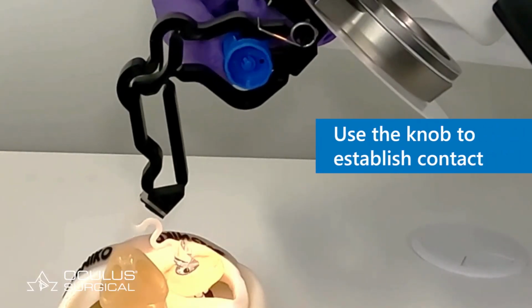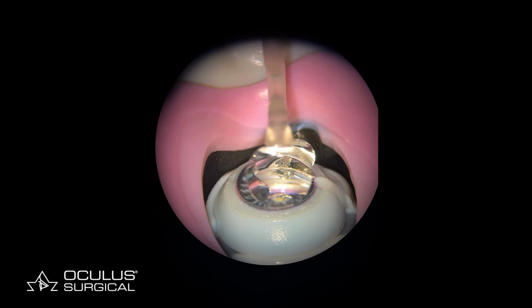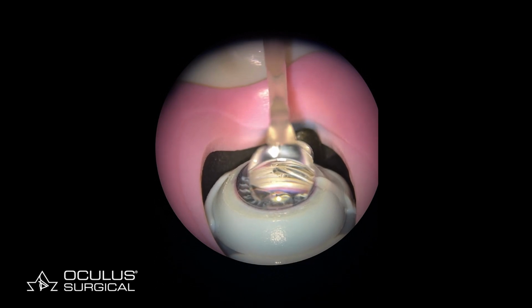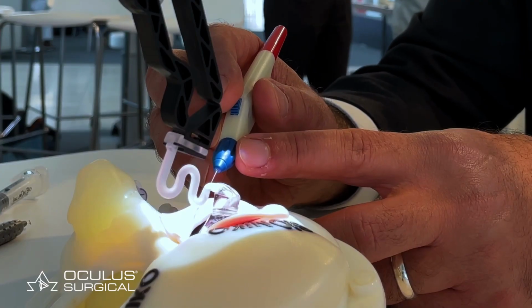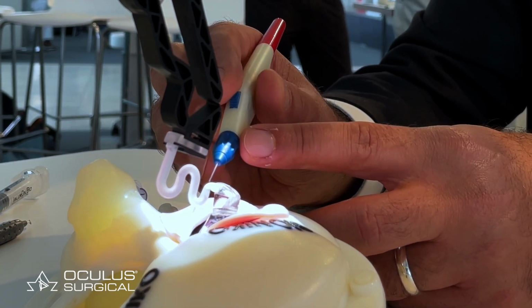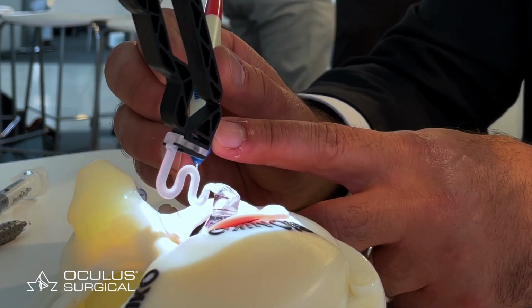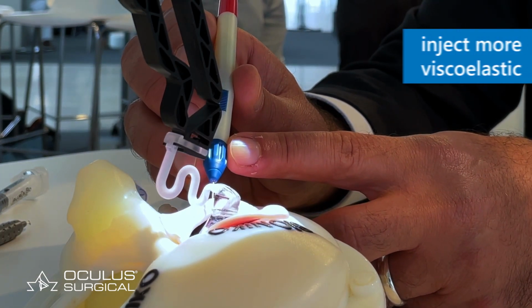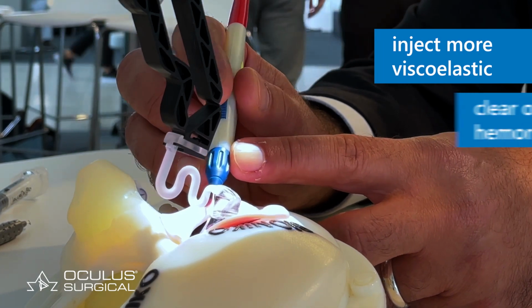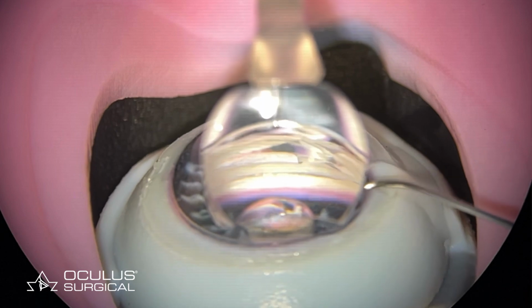Next, we use the knob on the Gonio Ready just to establish further contact, and we can also use the operating room microscope to establish a nice view of the trabecular meshwork. A nice stable view allows the surgeon to use both hands on the instrumentation for the MIGS portion of the procedure, which provides really great control. It also allows the surgeon to use another hand to further inject viscoelastic as needed or clear out any hemorrhage as needed. So here we've established view of the trabecular meshwork.